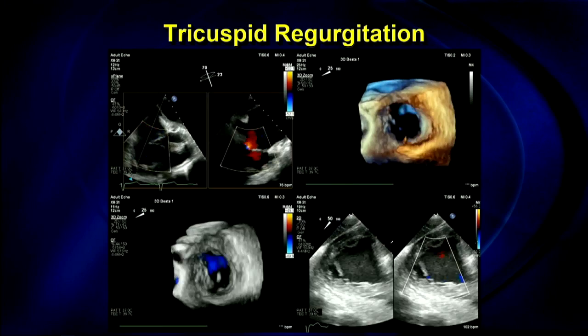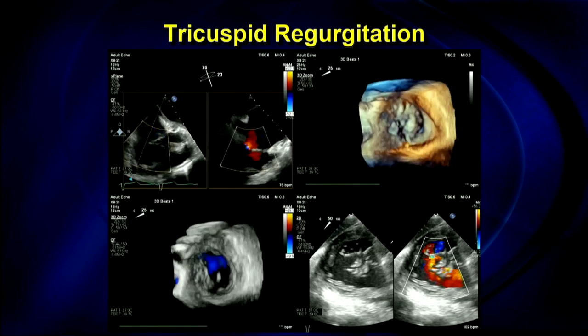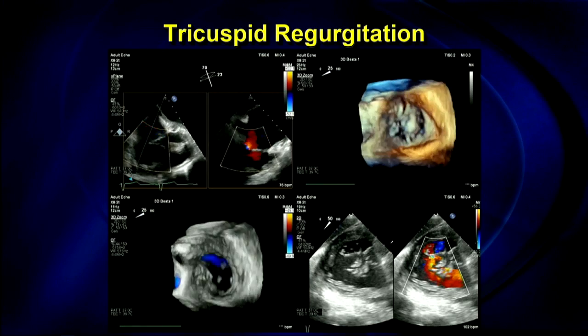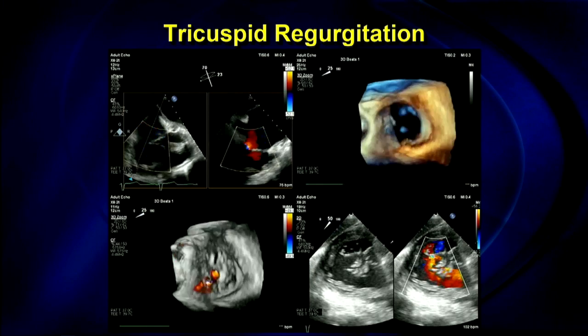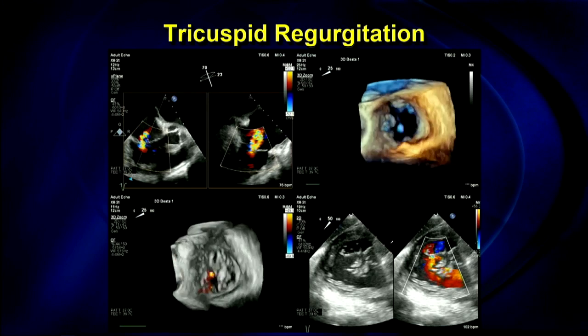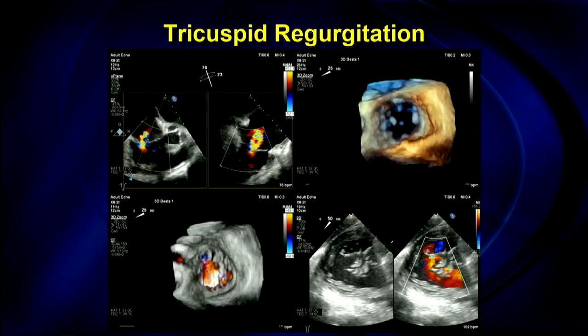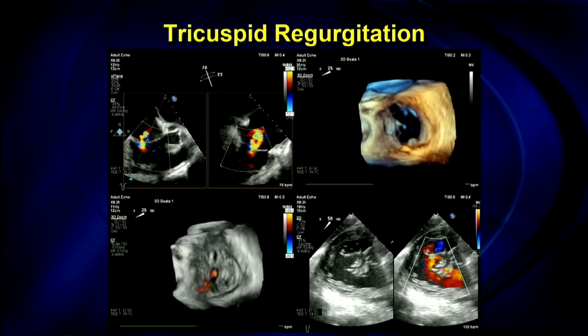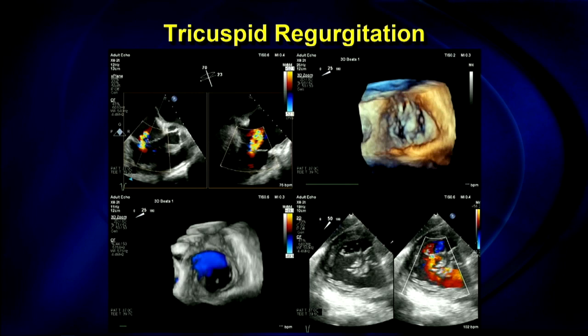So that, and also this short axis view at the esophageal position at the base. This is analogous to, with MitraClip, you get the commissural view on the left and your grasping view on the right. Here you can see the 3D images on this patient aren't that bad. You get a general sense of where the tricuspid regurgitation is coming from. But you can see on the transgastric views, let me try that again.